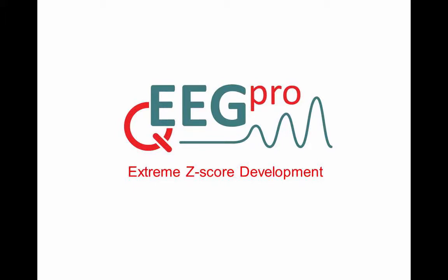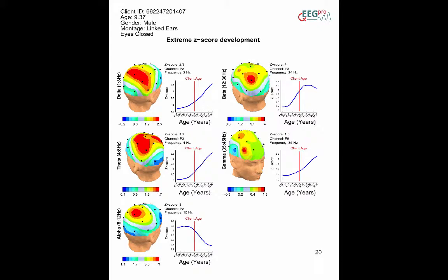Extreme z-score development. The extreme z-score development analysis is based on absolute power deviances and consists of two parts.